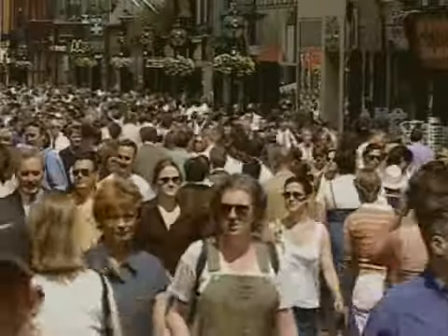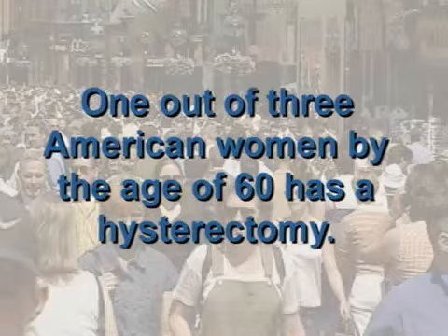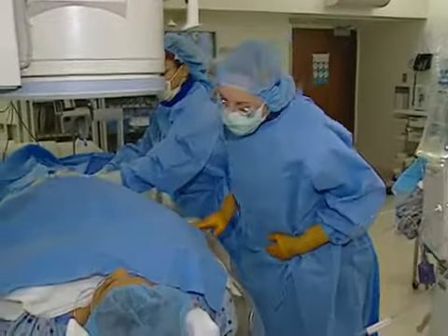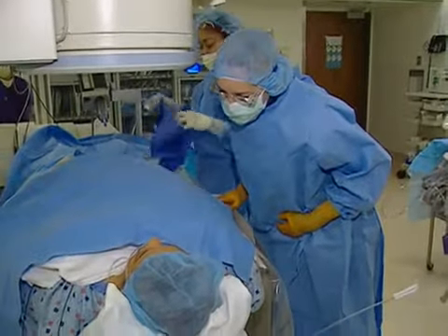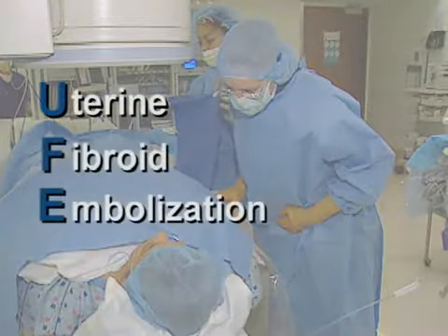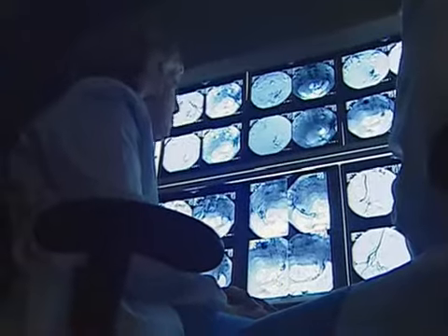In fact, 1 out of 3 American women by the age of 60 has a hysterectomy, and the most common indication is fibroids. However, there are now minimally invasive uterine-sparing procedures to treat fibroids, such as uterine fibroid embolization. This is the fibroid embolization we perform today.